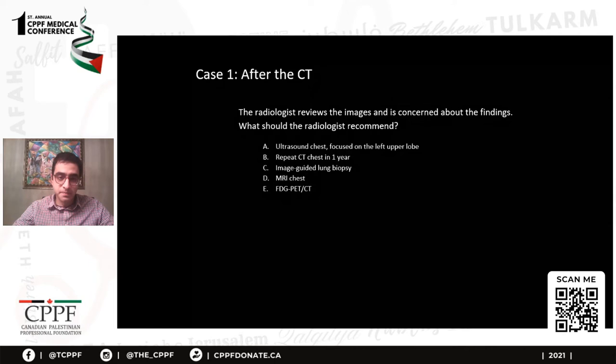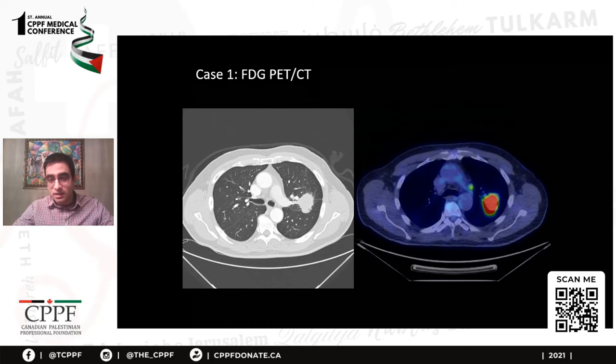Okay, time is up. So we actually have two correct answers at this point. You can do an image-guided lung biopsy or a PET CT, and we'll talk about that. So here's a PET CT. So on the left, we have a conventional CT scan, and on the right, we have a PET scan overlaid on CT for the same patient.